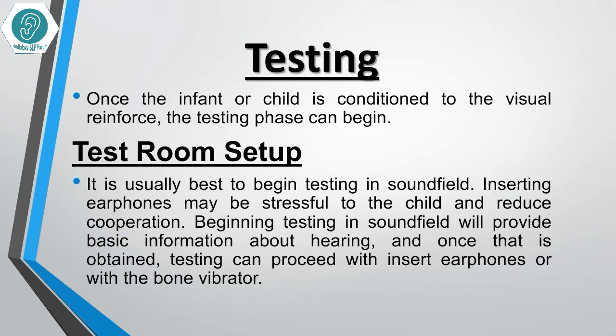Beginning testing in sound field will provide basic information about hearing, and once that is obtained, testing can proceed with insert earphones or with the bone vibrator.